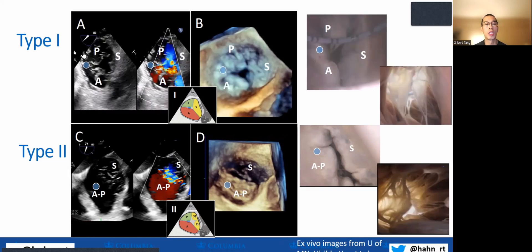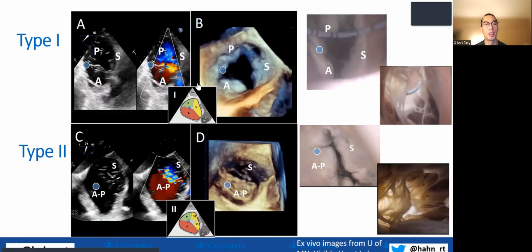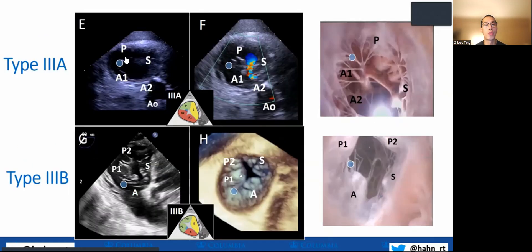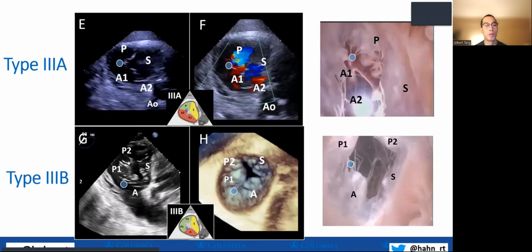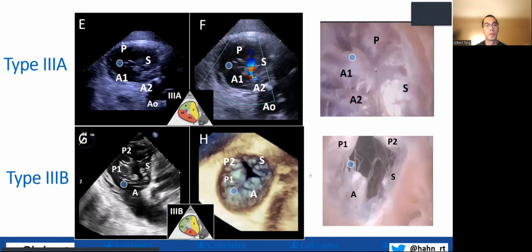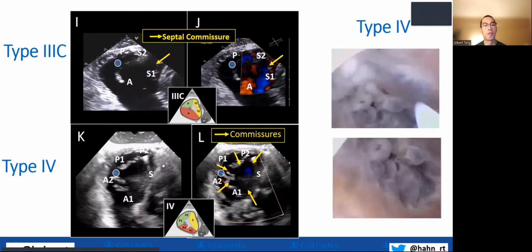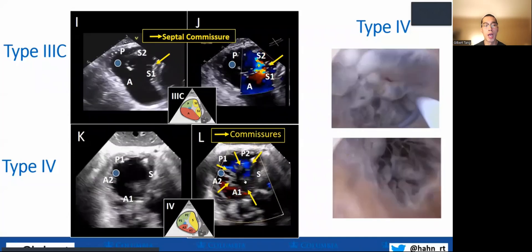Type 1 is a classic three-leaflet valve, shown here with a beating heart model simulating the same with a lead. Type 2 is almost like a bi-leaflet valve. Type 3A has two anterior leaflets, which is rather unusual. Type 3B has two posterior leaflets and is more common. Type 3C has two septal leaflets, which is rather rare. And type 4 is a five-leaflet configuration — likely the most difficult to treat with T-TEER because of the multi-scallop anatomy.